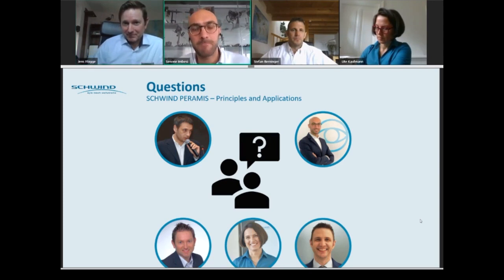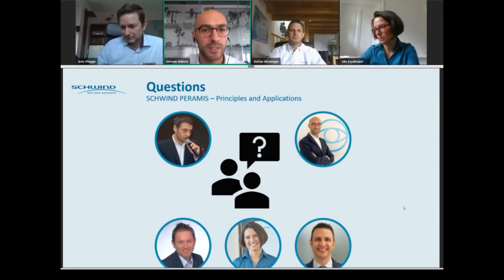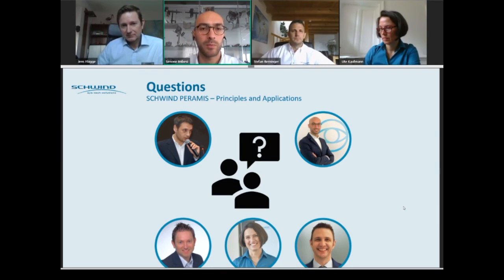It is a good question. Maybe the most accurate way is not using the refractive power map if you want to analyze the morphology. If you need to analyze the morphology, I suggest to use a tangential map, if you want to analyze the diameter of the treated zone. If you want to analyze the refractive outcomes, you better use the refractive power map.